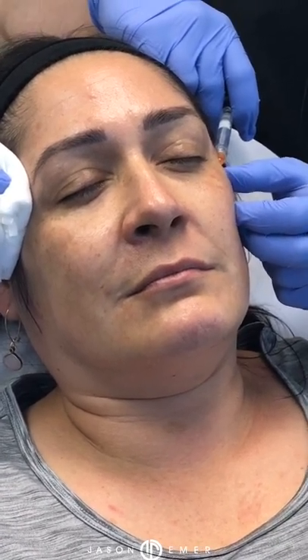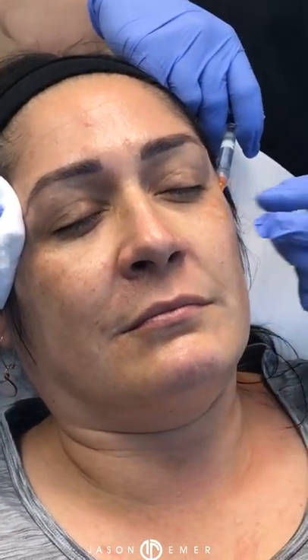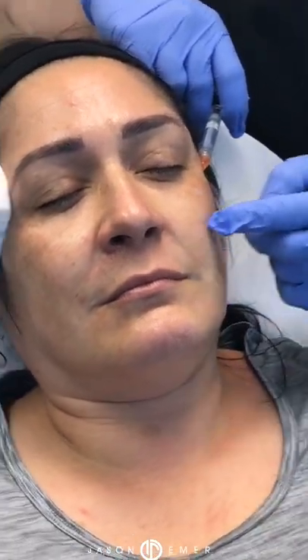I'm just going nice and slow. I like to take this area really slow, following a line from the corner of the mouth all the way up to the lateral part of the face to the top of the ear. This is the line we're looking for. That's the beauty line. That's what the makeup artists use to really shadow and contour the lateral cheek. That's what we're going to use to build shape.